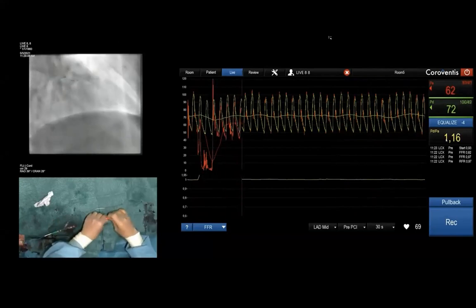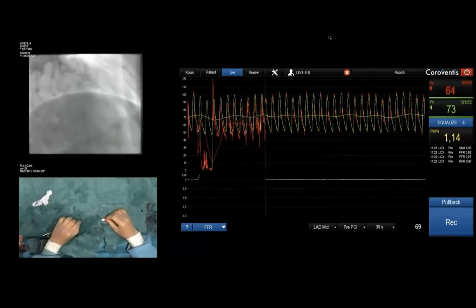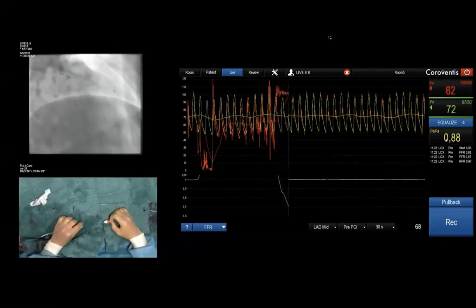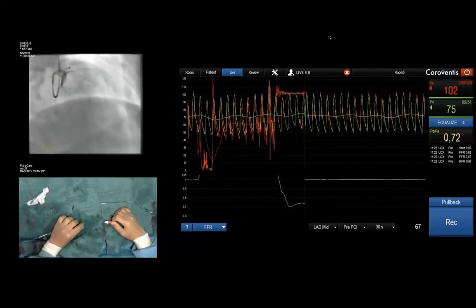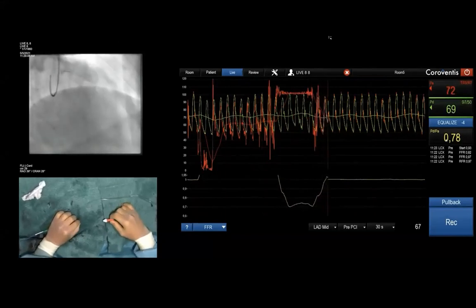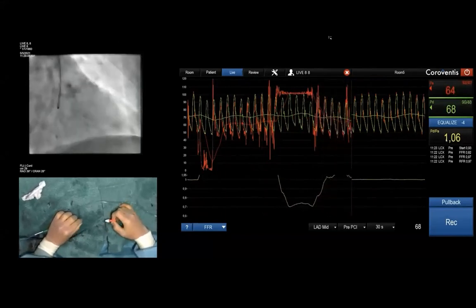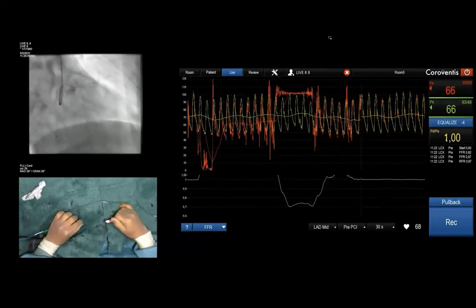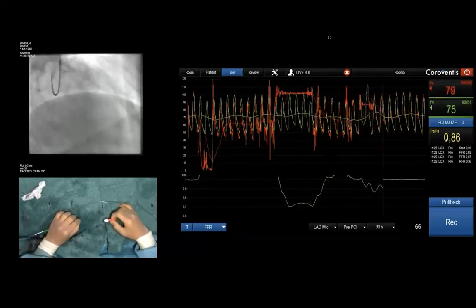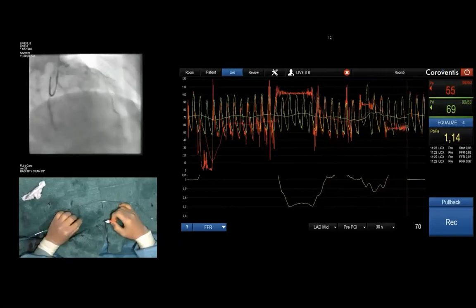When we do this exercise, what we like to do is flush the guiding catheter from any residual of contrast medium. There is some tortuosity there. I will do very gentle movements, and of course there are lots of septal branches and diagonal branches on the way. We try to avoid visiting all of them.